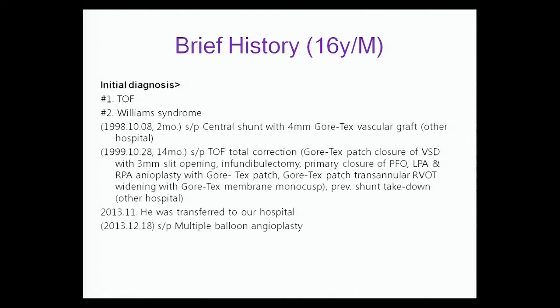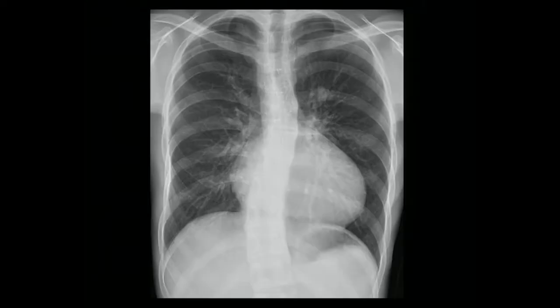This is a 16-year-old male patient. Initial diagnosis was TOF and Williams Syndrome. At 2 months of age, central shunt with a 4mm Gore-Tex vascular graft was performed at another hospital. At 14 months, total correction was performed at another hospital. Last year November, the patient visited our clinic, and in December, multiple balloon angioplasty was performed.